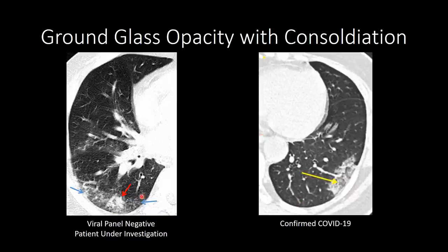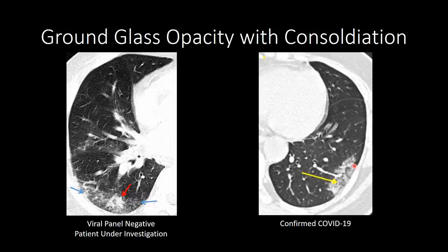When you see ground glass opacities with superimposed consolidation, we can see in a patient under investigation an area of peripheral ground glass opacification with a more focal area of consolidation superimposed. This is a case of confirmed COVID-19 where the patient has a peripheral area of consolidation, though some areas of ground glass opacification remain within the more consolidative airspace opacities.